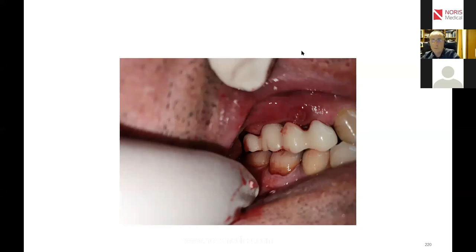Here I can show you, I hope that you can see it very well. I'll try to focus it maybe better. The key after all is a little bit opened and then it just clicks to the implant and then there will be no problem. I cannot really assure it because I am a very small picture in the monitor, but here I can show you that you can insert it in an unlimited torque at all because you cannot break the neck.